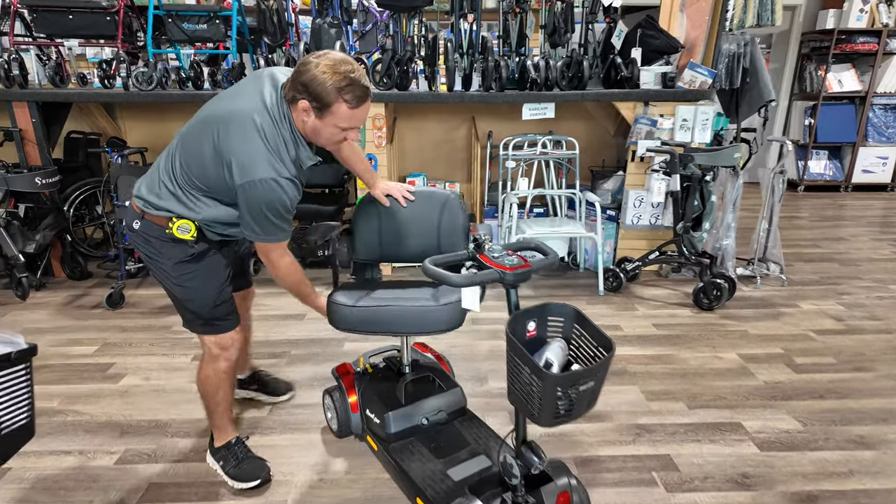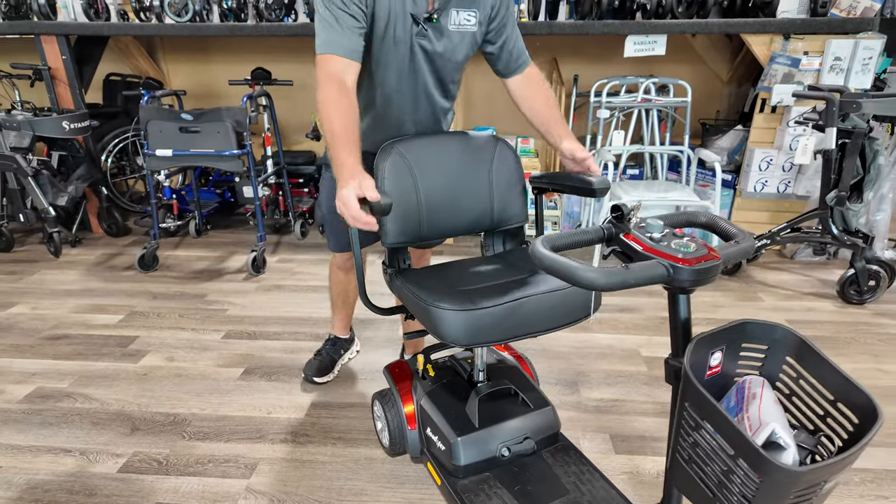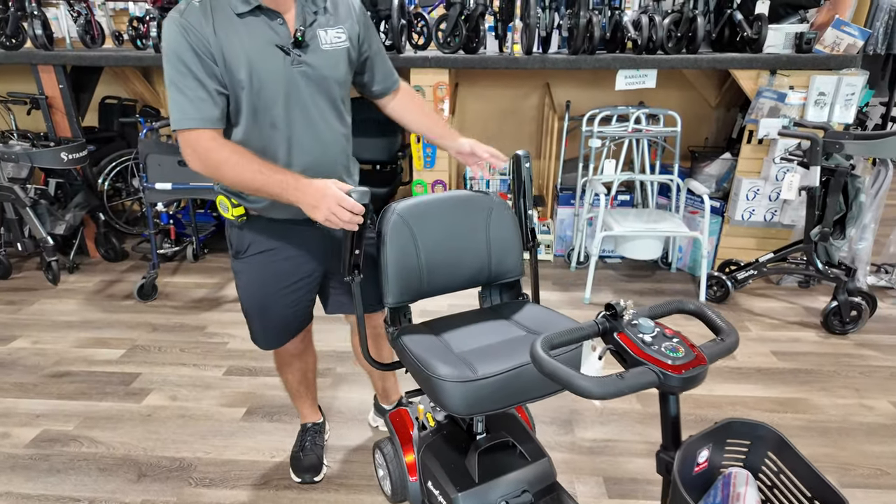Here's your swivel seat. The arms can flip back, adjust out, or be removed entirely.